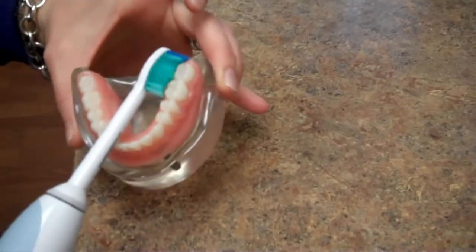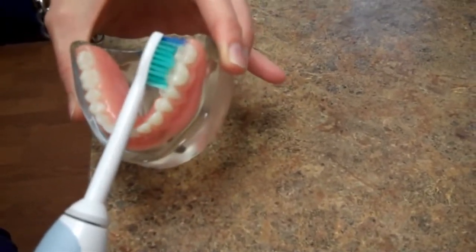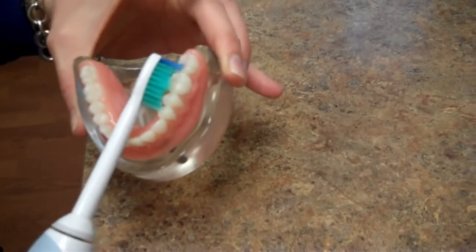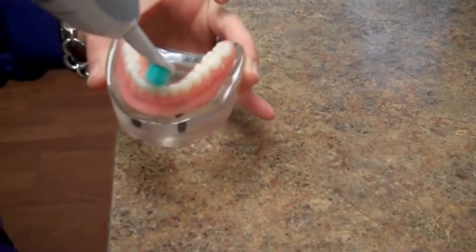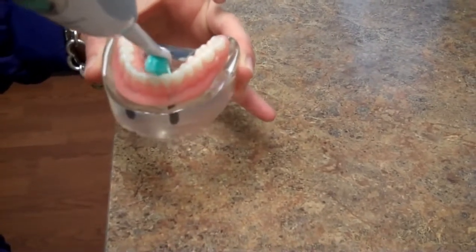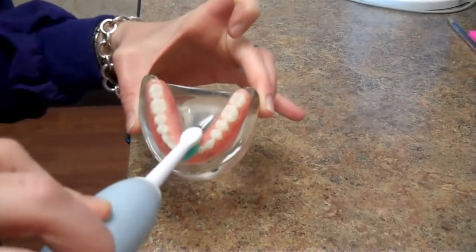You want to make sure you get the outside of the tooth and gum as well as the inside of the tooth and gum. Where the arch gets skinnier, it helps to hold the brush vertically if you have a narrow arch to more effectively remove plaque.